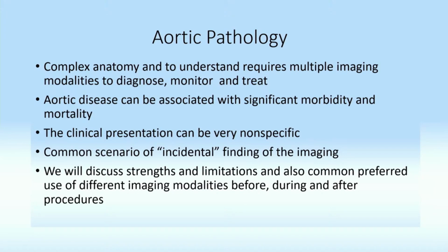Aortic disease can be associated with significant morbidity and mortality, as we all know. The clinical presentations can be very non-specific. Sometimes people just don't know that they have any problems. A very common scenario in our echo lab, and our techs who are sitting there know this very well, is that someone shows up with a little bit of shortness of breath, and we find something that's really significant. And these are the incidental findings.